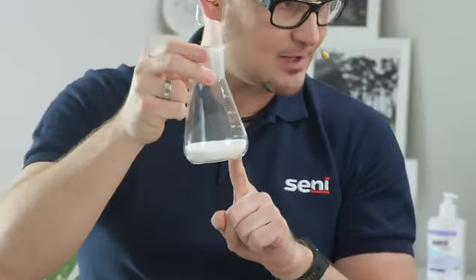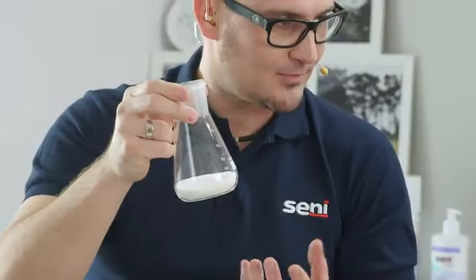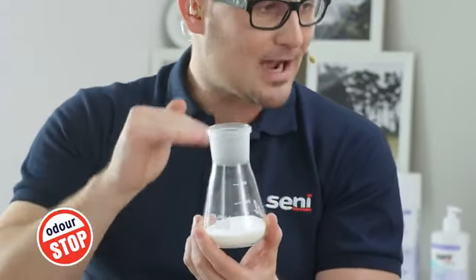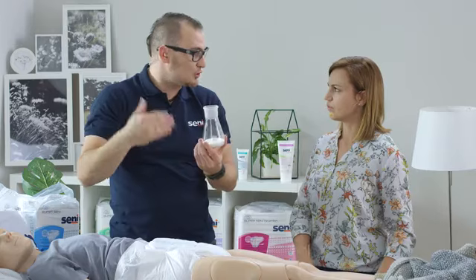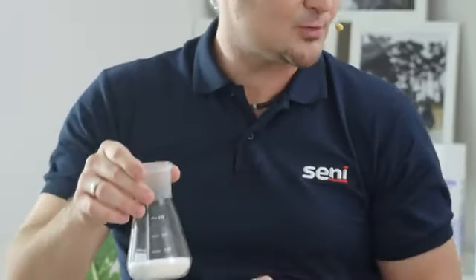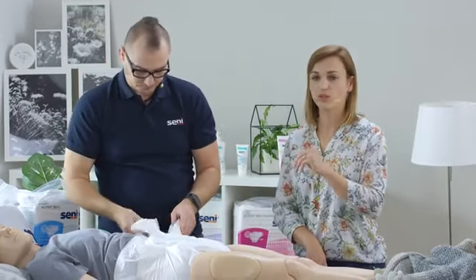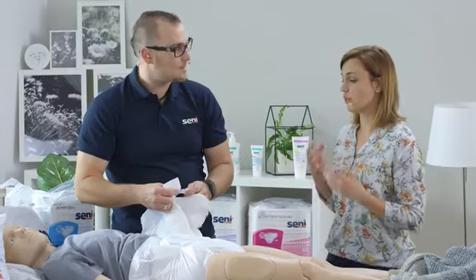This is a very important element of product construction because it turns into gel and gives the patient a feeling of dryness. So it super absorbs, right? It super absorbs liquid, moisture, but also absorbs the unpleasant smell of urine. Odor stop function means that the smell of ammonia that can be present in the apartment or in a public place if a person is active and walks, then in fact, odor stop neutralizes the unpleasant smell, blocks it, thanks to which we have this freshness. This is very important for persons suffering from urinary incontinence, but also equally important for people living or spending time with them. You stay in these products 24 hours a day, 7 days a week.